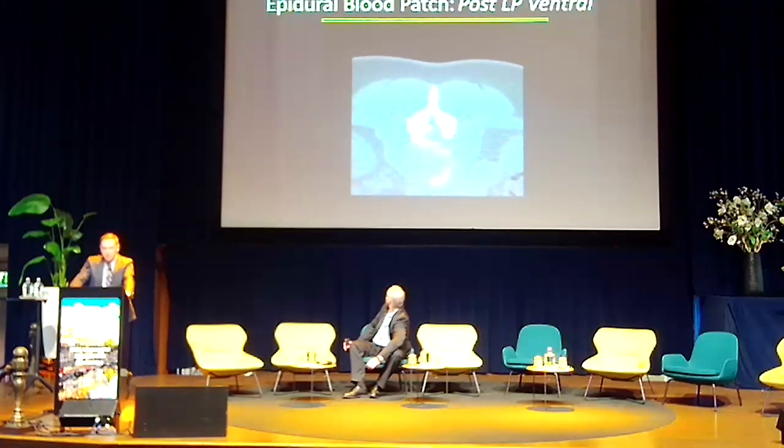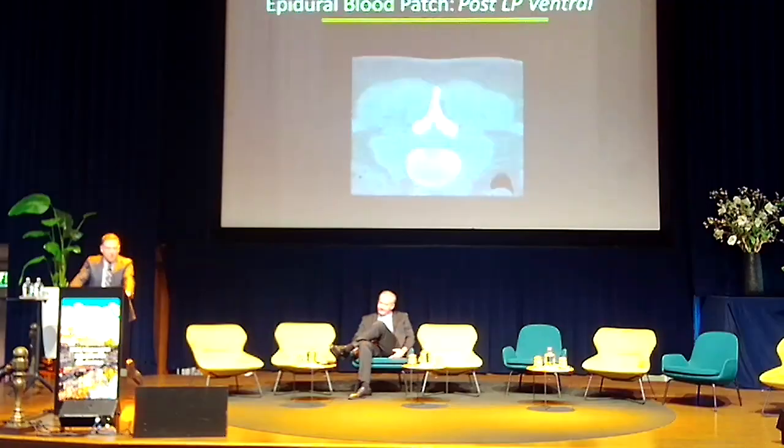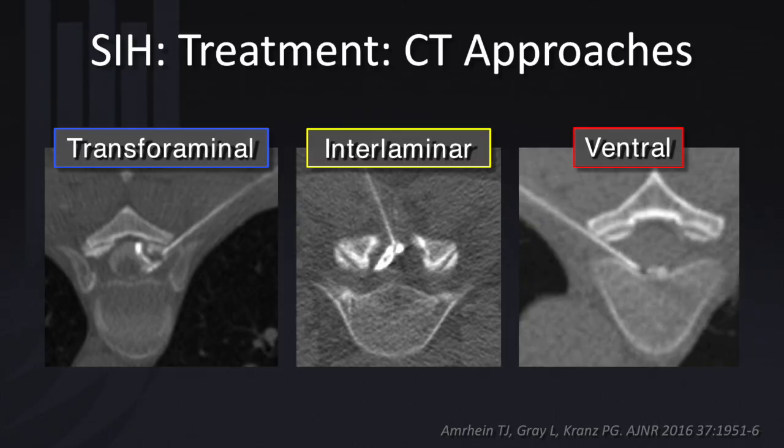I certainly don't want to transgress the lateral aspect of the dura and create another leak, right? And so that's the challenge here. And you can see very nicely we're able to place it bilaterally and get spread all the way across. So that's been successful in many of our patients. But post-dural puncture headache occurs for a variety of reasons, not only after lumbar punctures, right? And so sometimes we have to do needle placements in the thoracic spine or higher.